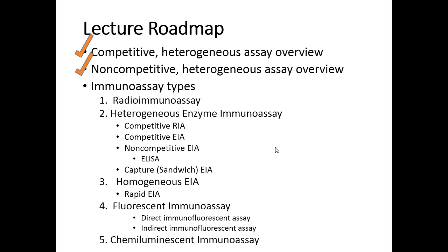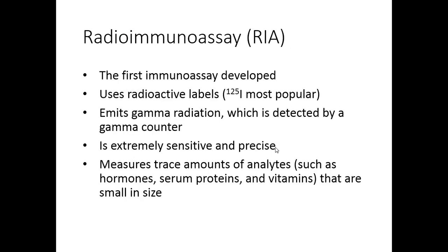So let's look at these concepts of competitive and non-competitive assays in each of the 5 immunoassay classes that we're really interested in. We're going to start with the heterogeneous enzyme immunoassay. Oh no, we're going to start with radioimmunoassay. So let's go to radioimmunoassay.